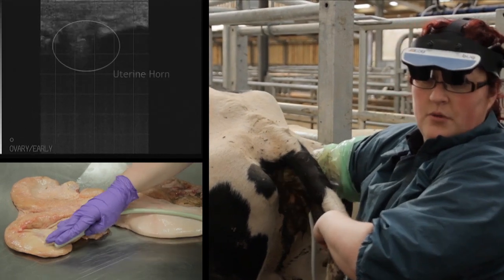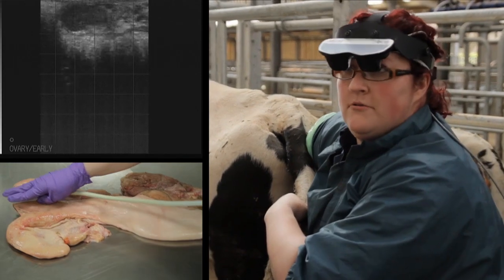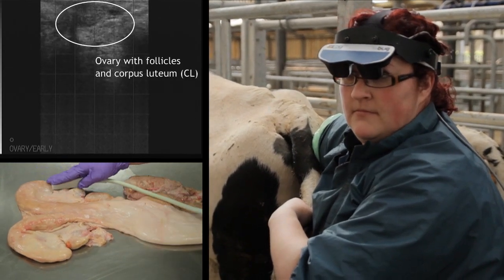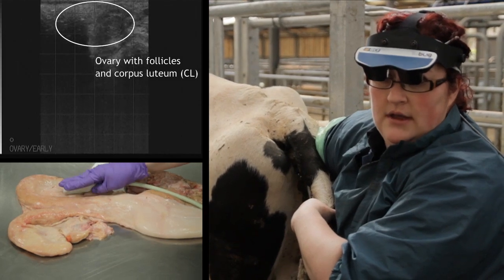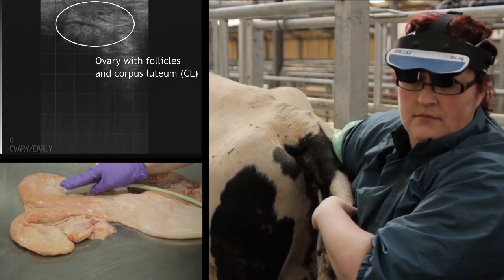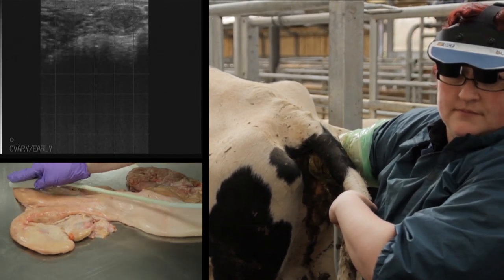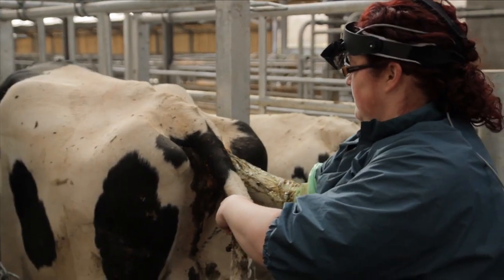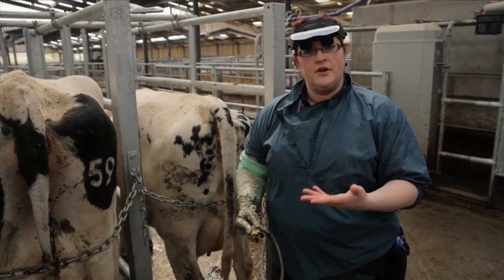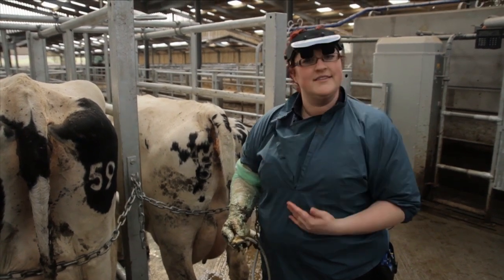Come back down to the body of the uterus, up the other uterine horn. Evaluate the ovary on that side. Back to the body, and then out once more. And this is the process that we follow to examine the reproductive tract using ultrasound in these cows.